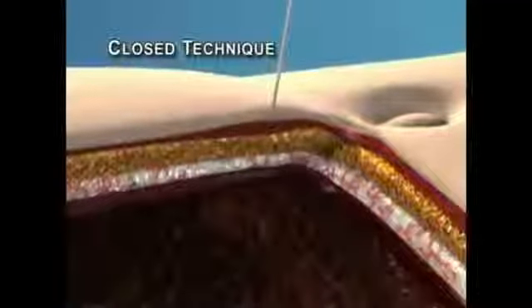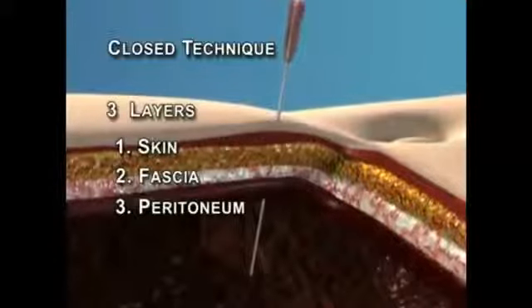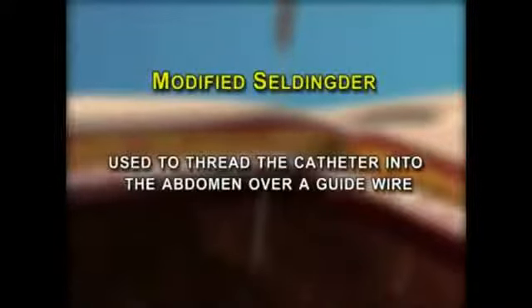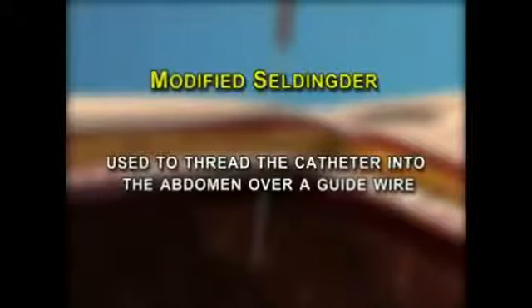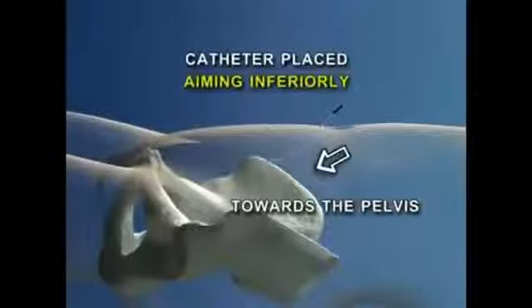Note, the closed technique uses an introducer needle to penetrate the 3 layers of skin, fascia, and the peritoneum. The modified Seldinger technique is then used to thread the catheter into the abdomen over the guide wire. The peritoneal lavage catheter is then placed into the abdomen, aiming inferiorly towards the pelvis.